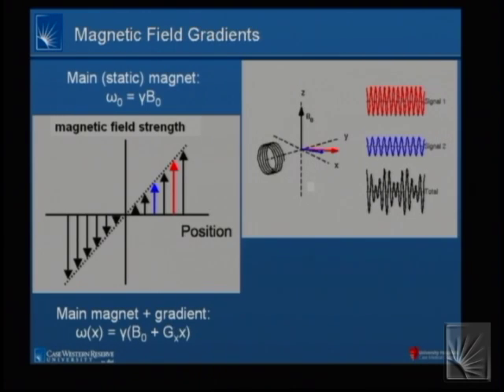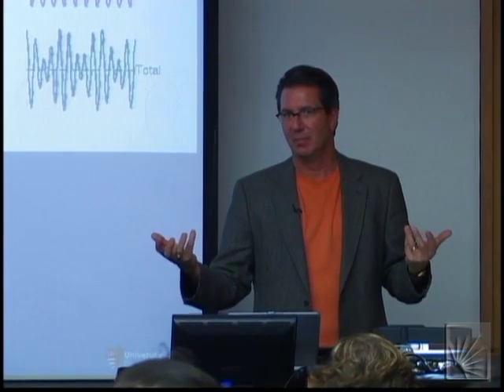It's a time domain signal. Right there. Okay, do a Fourier transform. Sample the signal, do a Fourier transform. The Fourier transform will extract for me which frequencies are present, which essentially is saying in which positions I have signal, because I have one-to-one mapping between frequency and position.